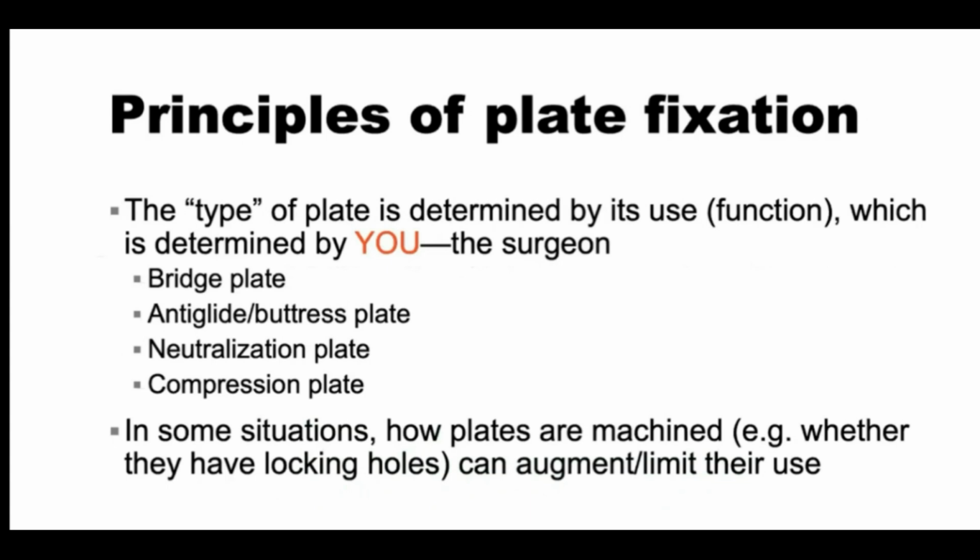So 2 points I want to talk about, because I think there can be some confusion about this. The first is that the type of plate, we're going to teach you some vocabulary about different types of plates or types of fixation, but it's really important to understand that the type of plate is determined by its use or by its function, and that is determined by you, the surgeon.